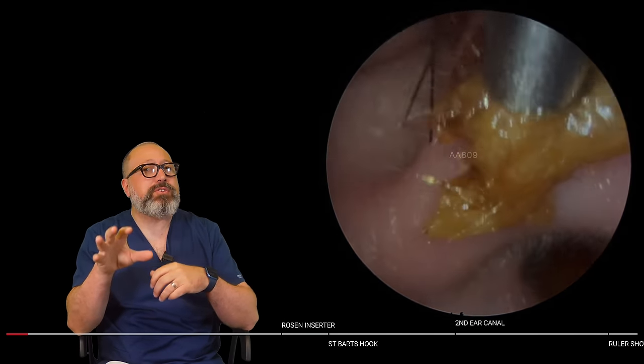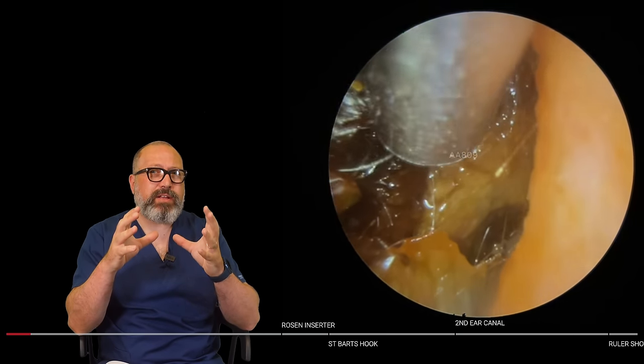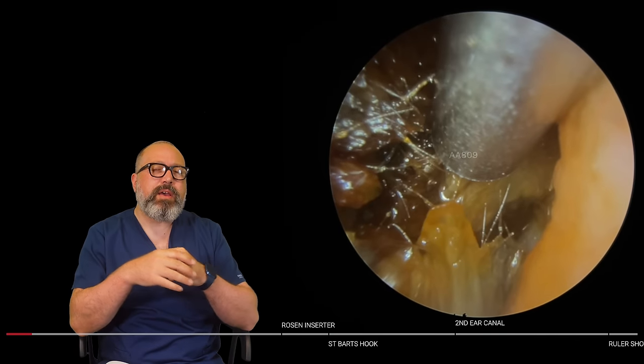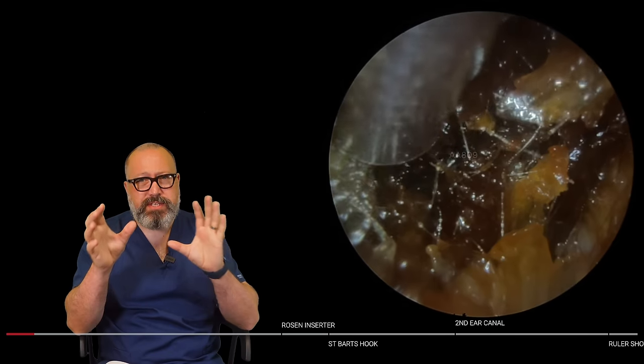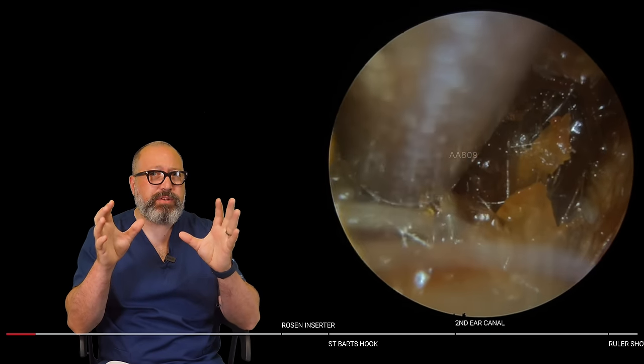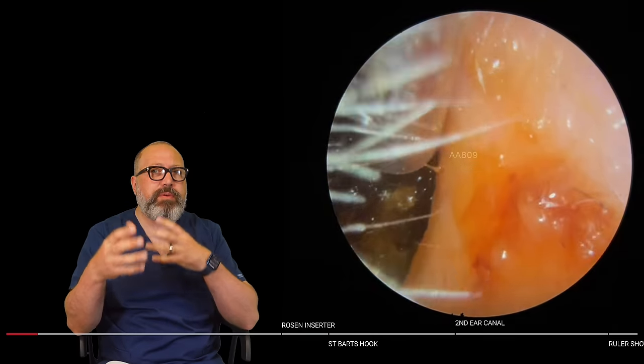This is the standard size Zoellner tube in here as well. So this is just going to give us that wider end, that bigger grip, to start pulling these bits of wax away. Now, this isn't one big continuous plug. This is lots and lots of layers in here, so it's a case of chipping away at this.